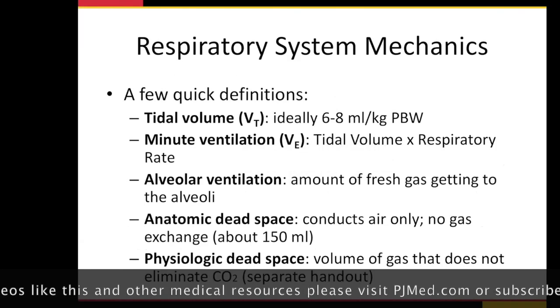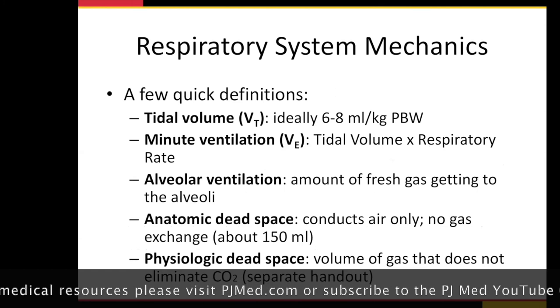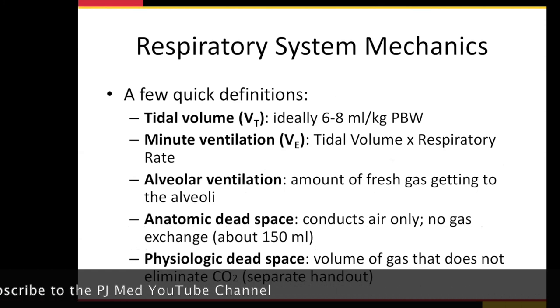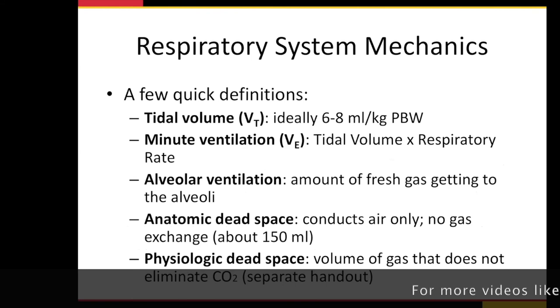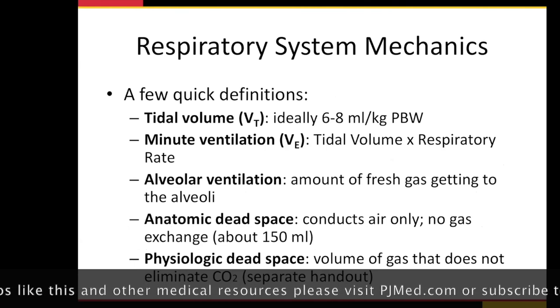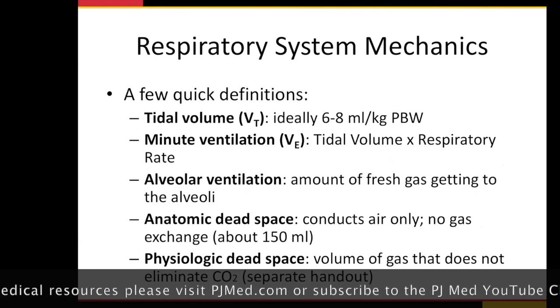All right, basics, a couple definitions. Tidal volume. This is one of the most important things. You can really hurt somebody with a ventilator. In fact, you can kill a patient if you put them on a ventilator. You really can. You can really hurt them quick if you're not careful. One of the things to be careful about, in evidence-based practice, some of which I'll share with you in a little bit here, really has to do with the predicted body weight. So you have to measure the patient's height.